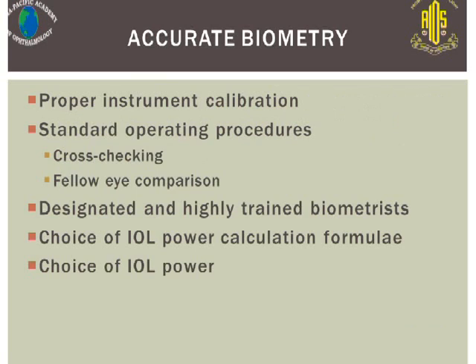Besides state-of-the-art optical biometers, for accurate biometry we need proper instrument calibration, and protocols to ensure that the procedures are carried out in a standardized format, with measurements taken for both eyes for cross-checking and repeated if there are suspicious deviations from each other. And biometry is a highly skilled process and should only be performed by designated and highly trained professionals, be they doctors, nurses, optometrists, or technicians.